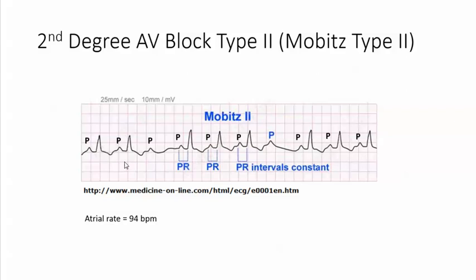The next thing I want to do is look at this QRS. It is wide — it's 0.16 seconds. Normal is less than 0.10 seconds.